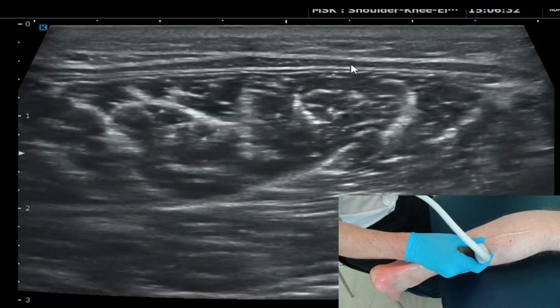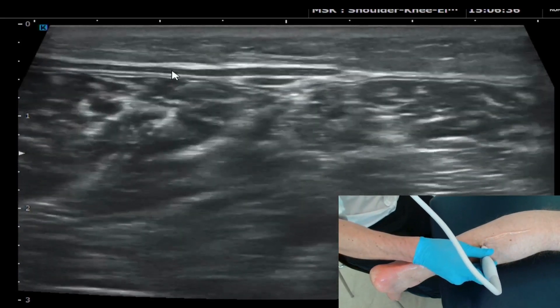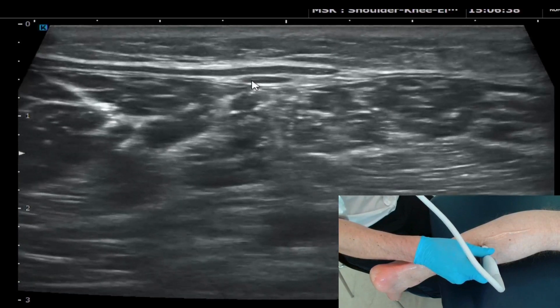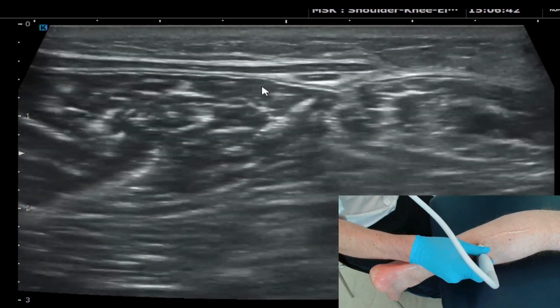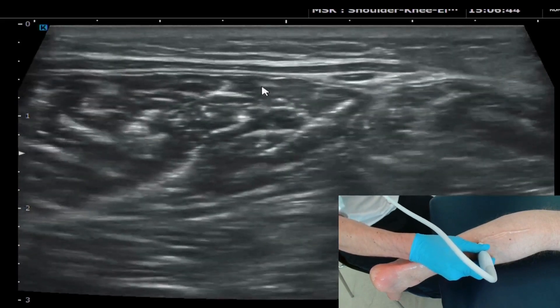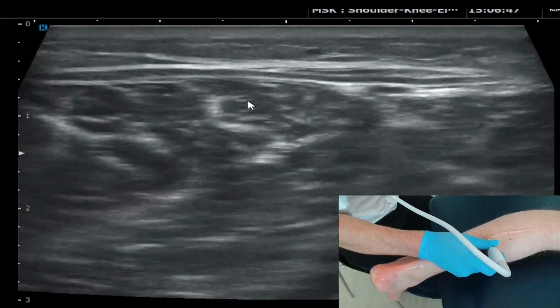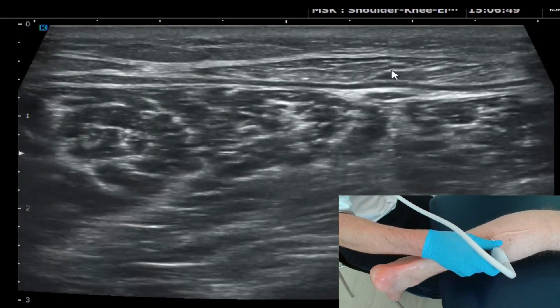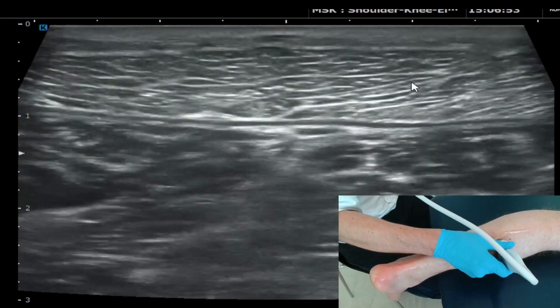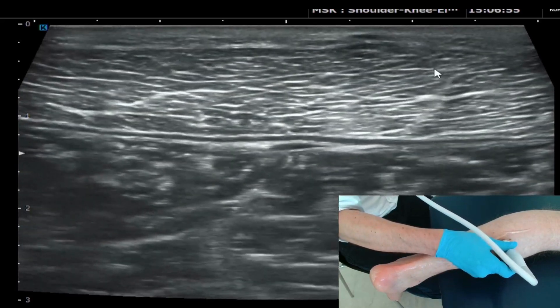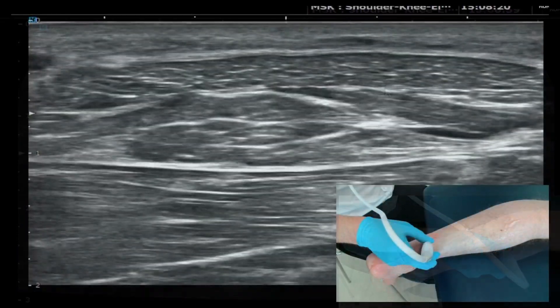At this point we start to see the heads of gastrocnemius appearing. You can see the small plantaris tendon sitting on the most medial aspect of the Achilles aponeurosis, just deep to it, and it ultimately sits between gastrocnemius and Soleus as we come up. Then, scanning more proximally, the medial head of gastrocnemius appears — it comes on earlier than the lateral head.